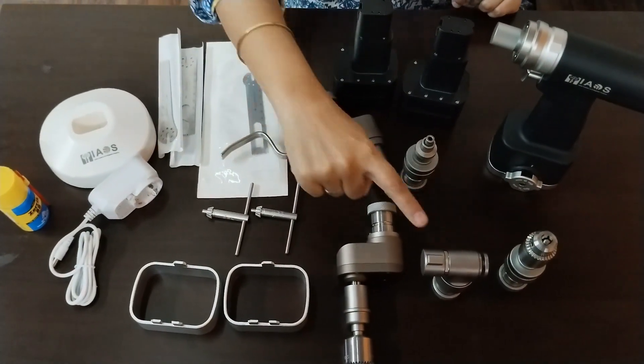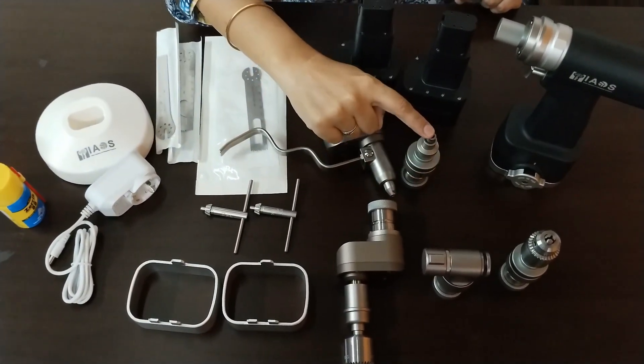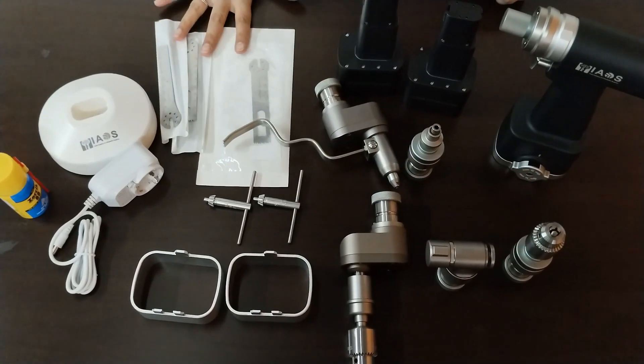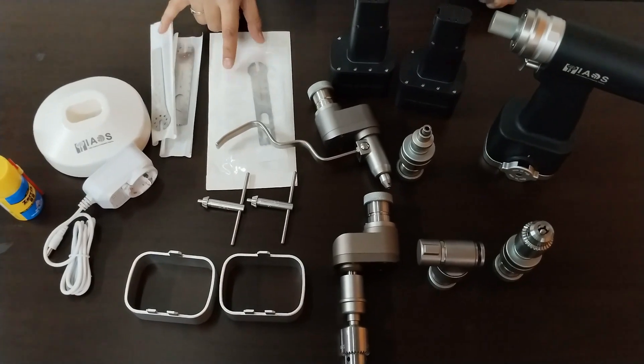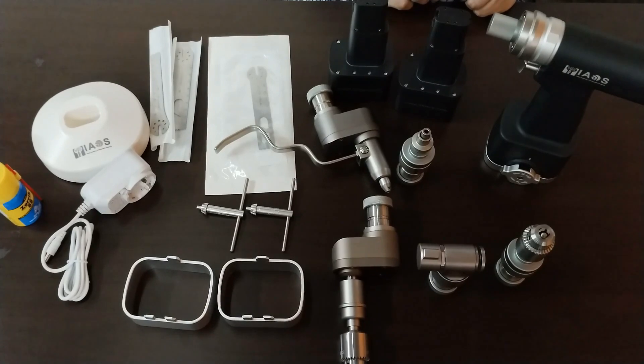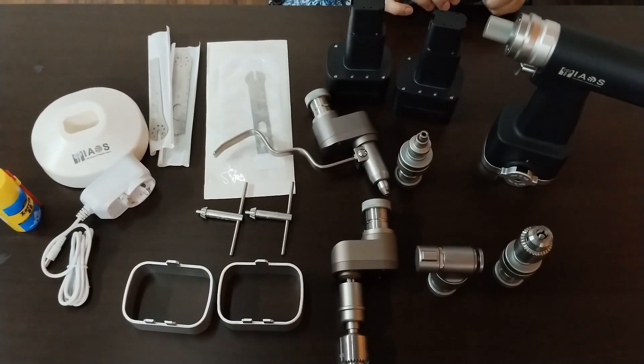It also includes a K-wire attachment, a sagittal saw attachment, a quick coupling attachment, a bone drill attachment with Jacob's chuck, three blades for the sagittal saw, and two chuck keys. Now let me walk you through the features and specifications of each of these devices.